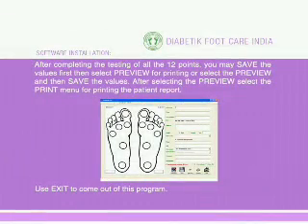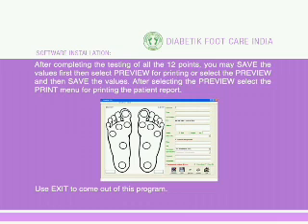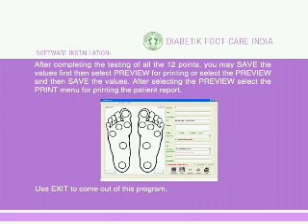After completing the testing of all 12 points, save the values first, then select Preview for printing, or select Preview and then save the values. After selecting Preview, select the Print menu for printing the patient report. Use Exit to come out of the program.